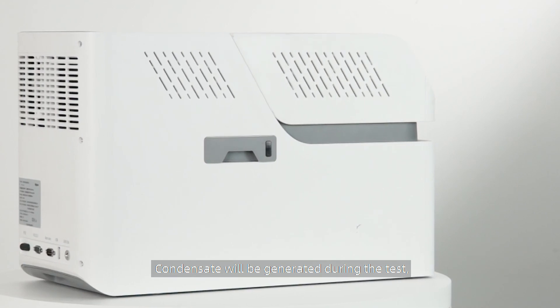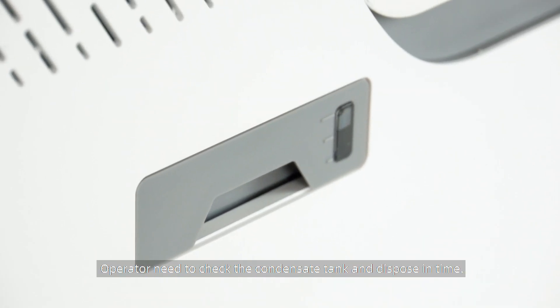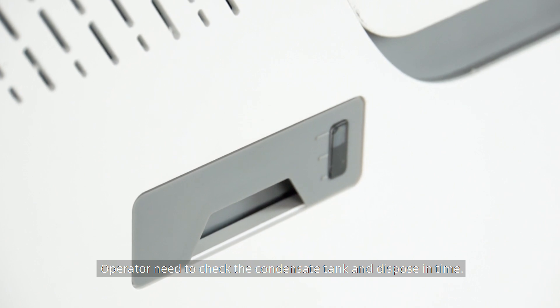Condensate will be generated during the test. The operator needs to check the condensate tank and dispose of it in time.